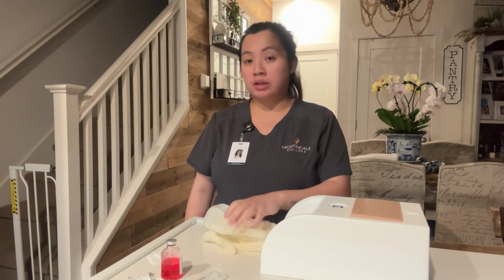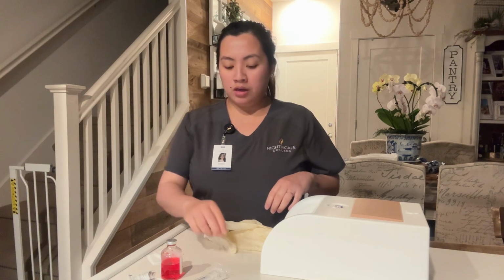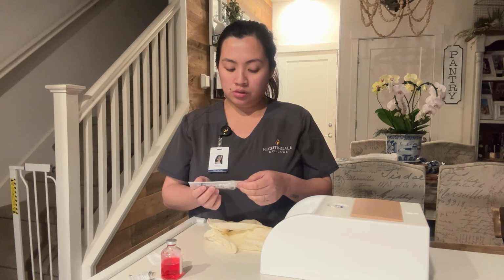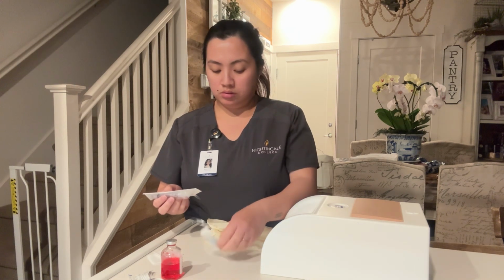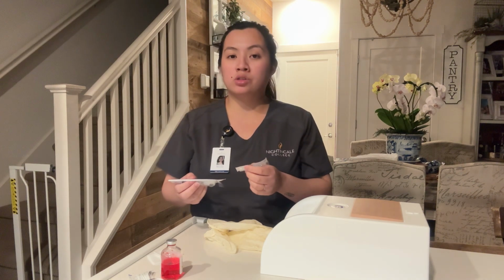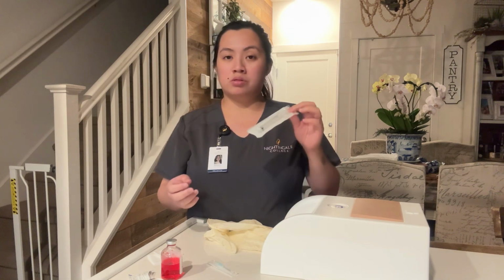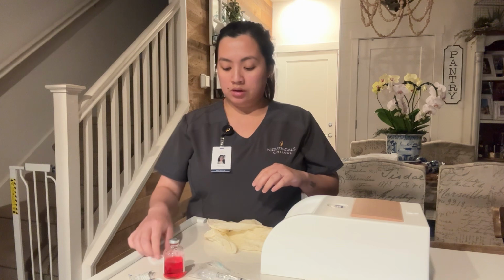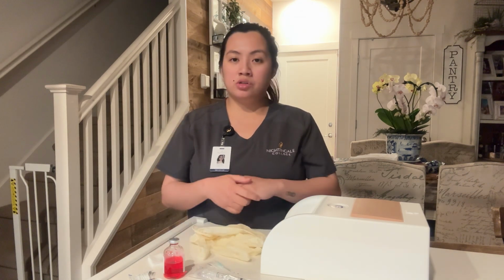I have my gloves, alcohol swab, and then I have a 25 gauge, 1 inch needle, and then I have a 3 ml syringe, and then the medication vial, the gauze, and we can use a bandage if needed.